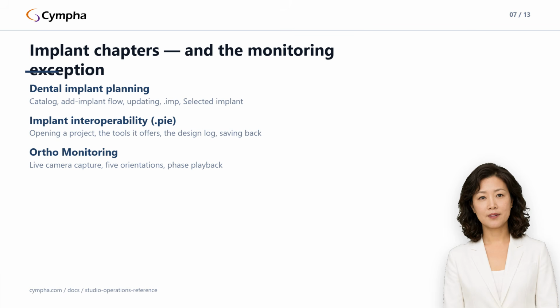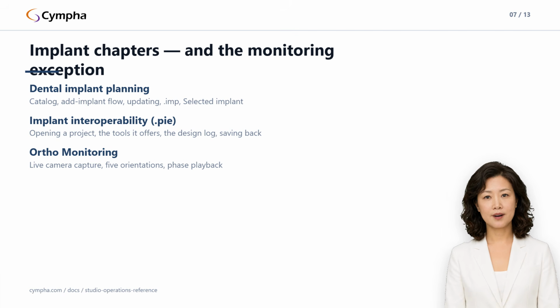Here's a taste of the level these chapters operate at. The cephalometric tracing chapter doesn't just say Studio can trace a lateral X-ray, it walks the dialogue phase by phase, opening the X-ray, the initial landmark prediction, the manual correction pass where you fix what the prediction got wrong, then the analysis, and how to save the tracing. That phase-by-phase structure is typical of the whole reference.